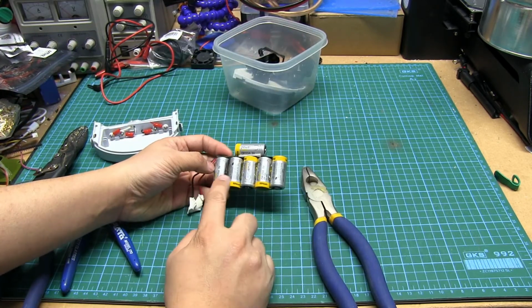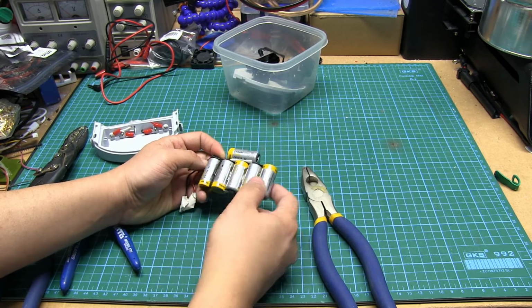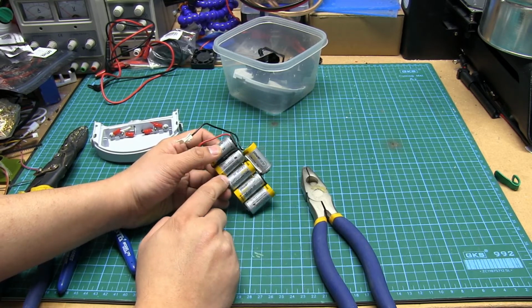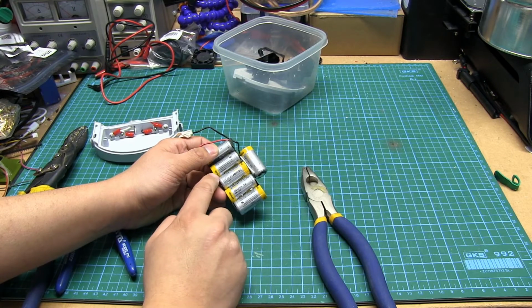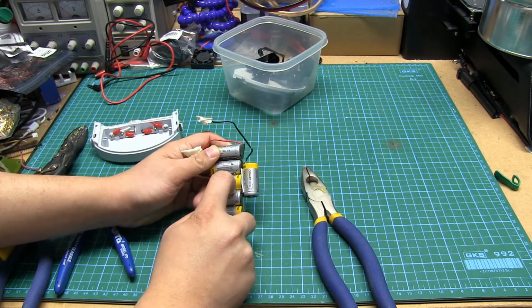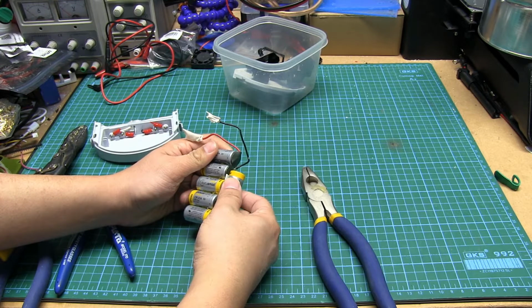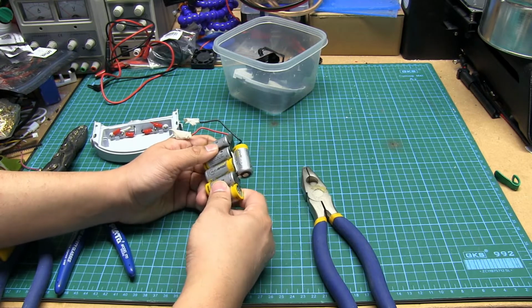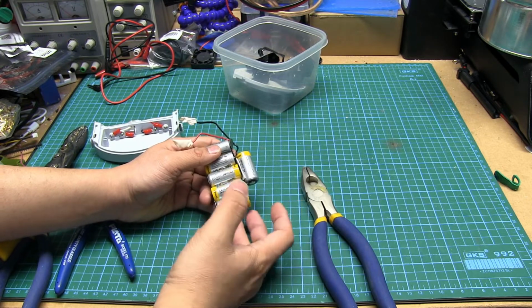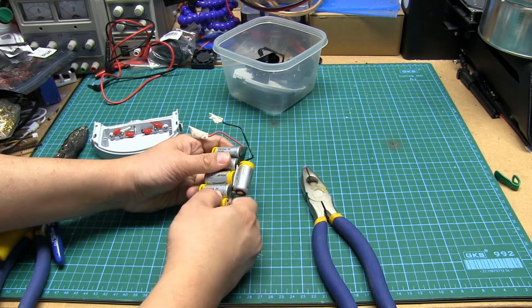We have 6 cells in series with some hot melt glue in between. Just based on the color, this actually looks like the good stuff. This is a polyimide glue. Polyimide might sound familiar because it's actually the polymer behind Kapton. You can get polyimide hot melt glues that are high adhesion, which definitely helps when you have low surface energy plastics, for instance. Very smooth plastics with very few polar groups for the glue to form bonds with.